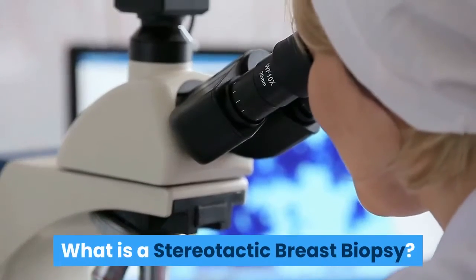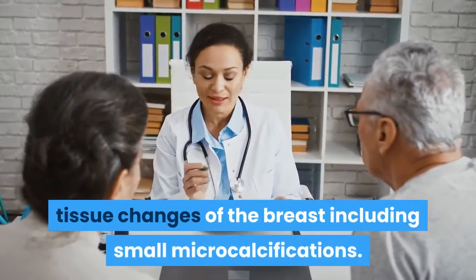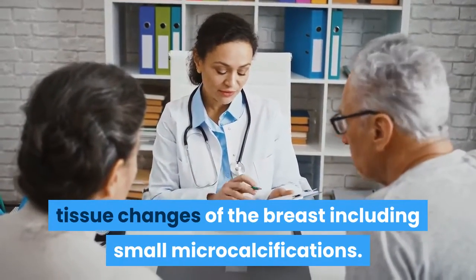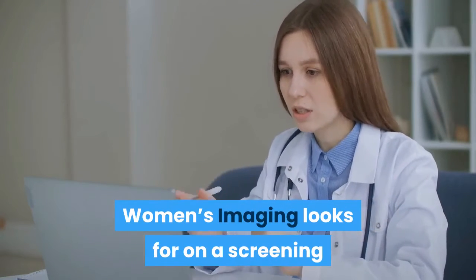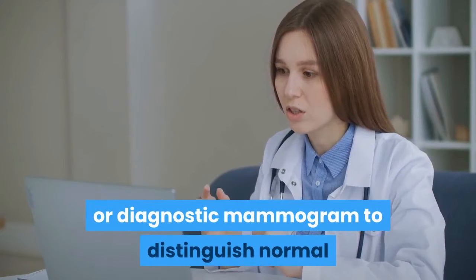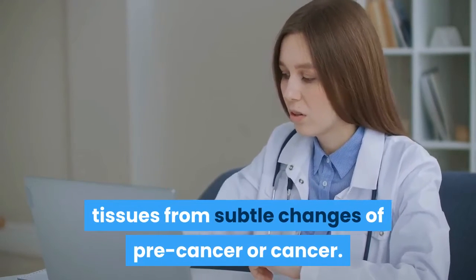What is a stereotactic breast biopsy? Radiologists specialized in women's imaging look for subtle tissue changes of the breast, including small microcalcifications. There are many findings that a specialized radiologist in women's imaging looks for on a screening or diagnostic mammogram to distinguish normal tissues from subtle changes of pre-cancer or cancer.